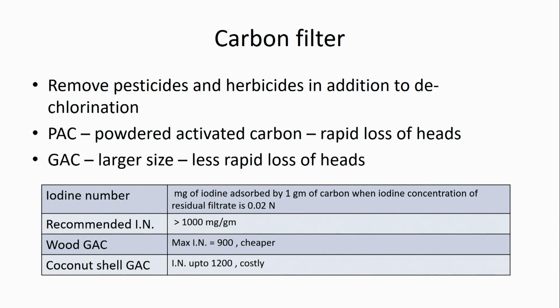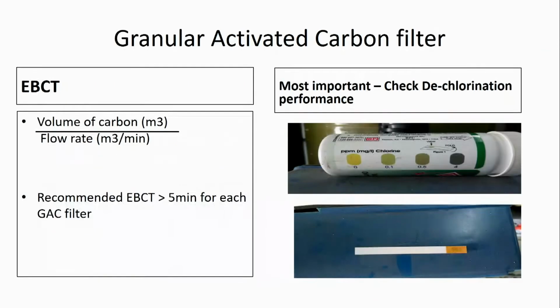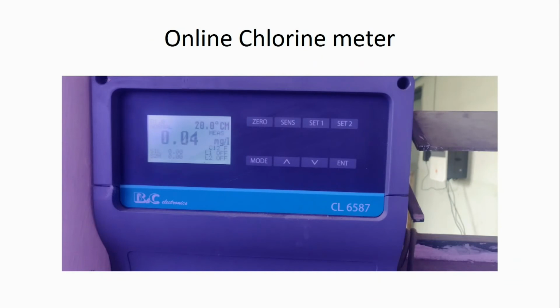Pritam: Sir, you mentioned that the deionizer should be recharged once or twice a week. Will it depend on how many dialysis sessions we have? Actually, you can monitor conductivity online, and if your conductivity is going beyond the limit, then you should recharge even if it is not due. Beyond limit means above 1. Maximum 1 is permissible here and there. Ideally it should be 0, but 1 is permissible. If it is going beyond 1, then you should recharge. But if after one week it is still not going above 1? Then it may go above 1 the next day. As I said, we have to prevent the problem rather than treat it. So ideally, it should be done every week.